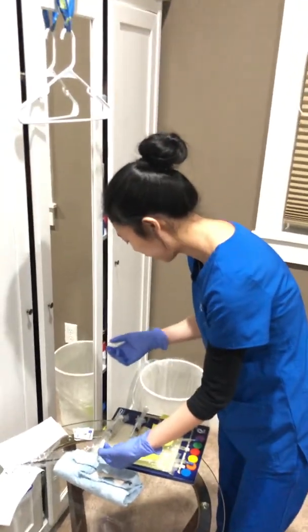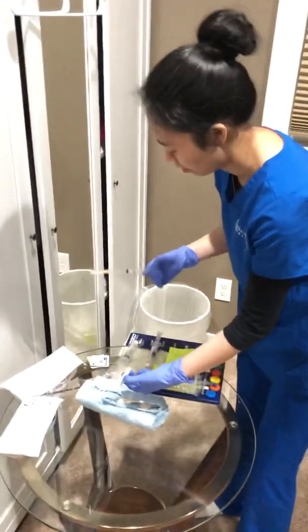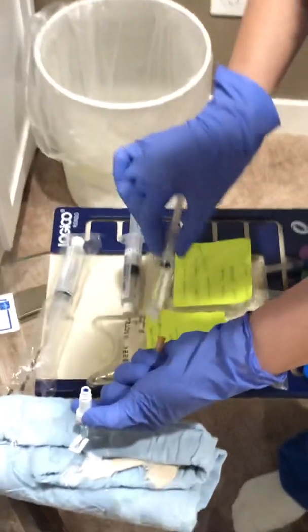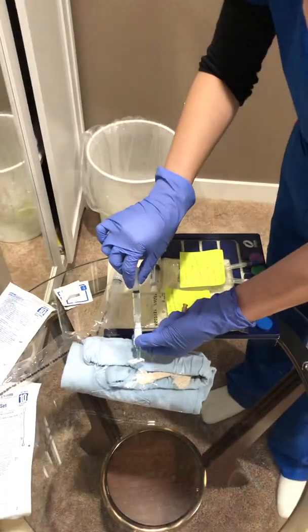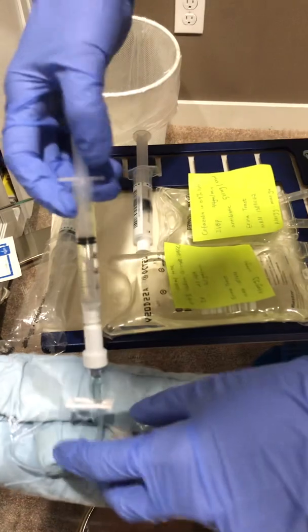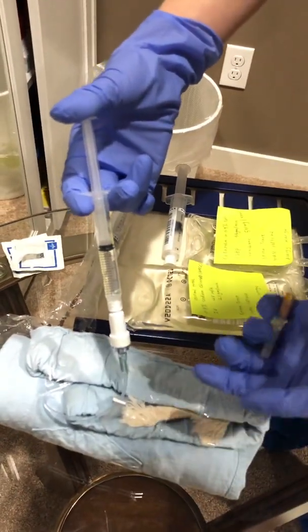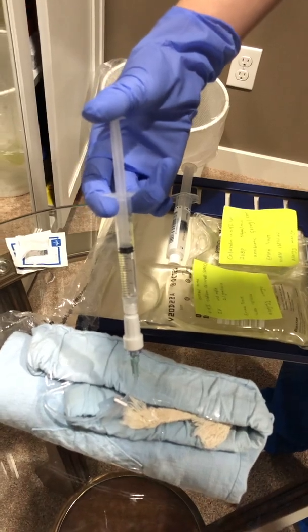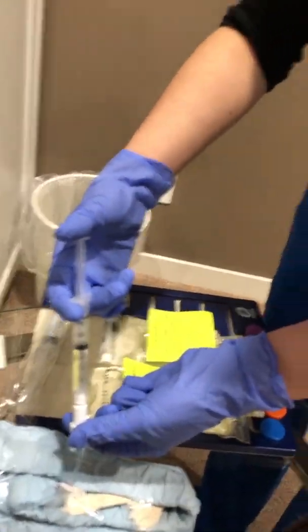And then now I'm going ahead to give you the ondansetron. Ondansetron. Sterile to sterile. Make sure there's no air bubble. Okay. Unlock it. And administer 2 milliliters, 4 milligrams, in 2 minutes.